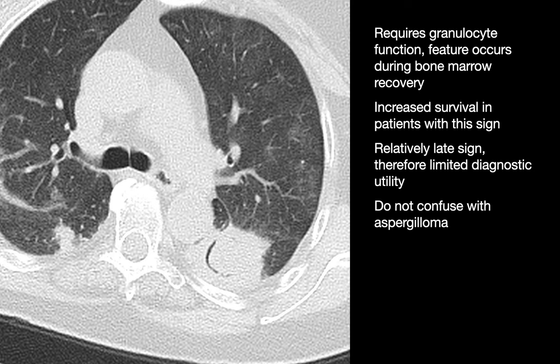This is a classic sign referred to as the golden S sign. In these cases, you see a central mass that forms the inferior part of the S. That central mass is often a large bronchogenic cancer causing obstruction of the right upper lobe airways. The more superior aspect of the S corresponds to the minor fissure, with an opacified right upper lobe on one side and lucent lung on the other.